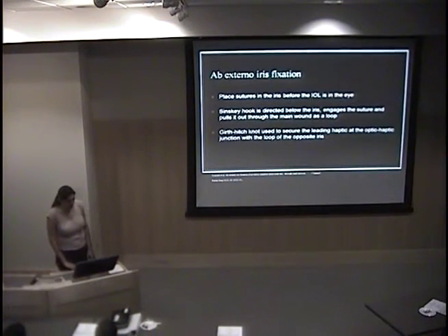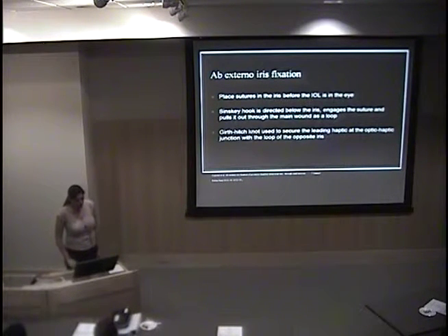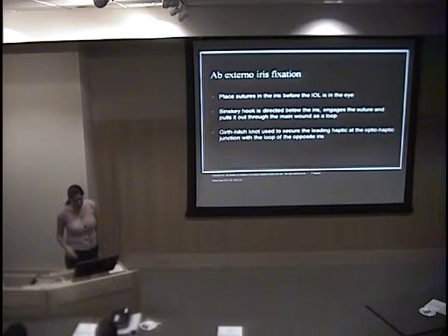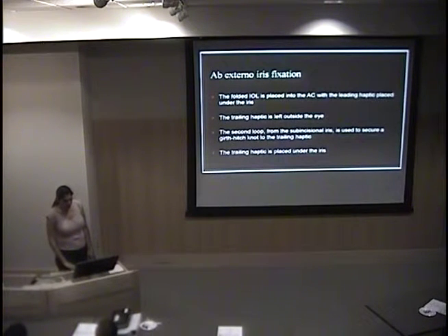Dr. Crandall wrote a paper in which he described placing the sutures in the iris before the lens is placed in the eye. I have a picture of this, so it'll make more sense when you see it. He basically passes the suture through the cornea, through the iris, back out through the iris, and back out through the cornea, and then he uses a Sinskey hook coming from across the eye, grabs the suture and pulls it out of the eye, and then ties a knot around the leading haptic, which is outside the eye.